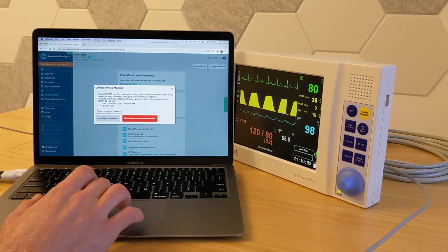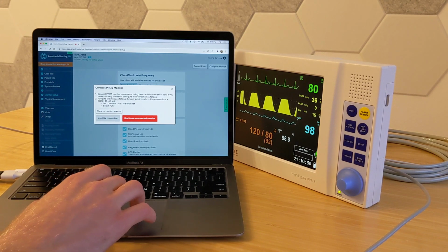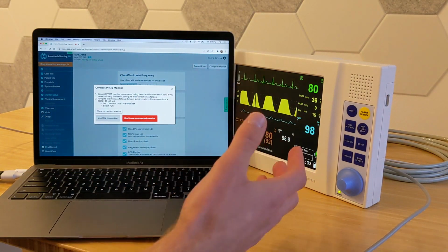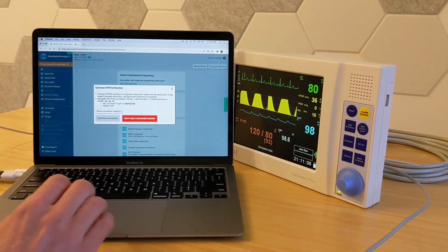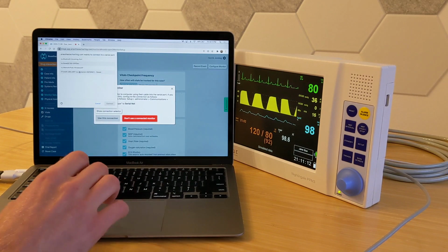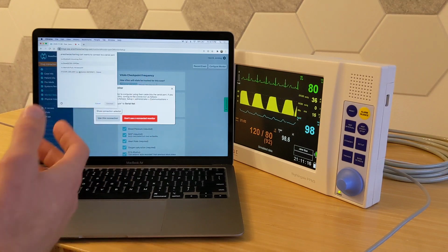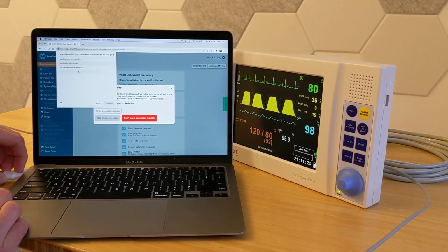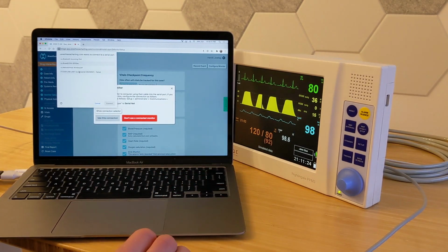And then I get a button here that says Show Connection Selector. It does give you a few instructions here on how to connect. There's a few settings on here that you may need to change, but only if you change them, because the default settings should work just fine. So I'm going to hit Show Connection Selector and then select the one that says USB and serial in the name somewhere. If you're not sure which one it is, one little trick, if you have multiple, it's just to disconnect it, and then whichever one shows up when you connect it, that's your connection.